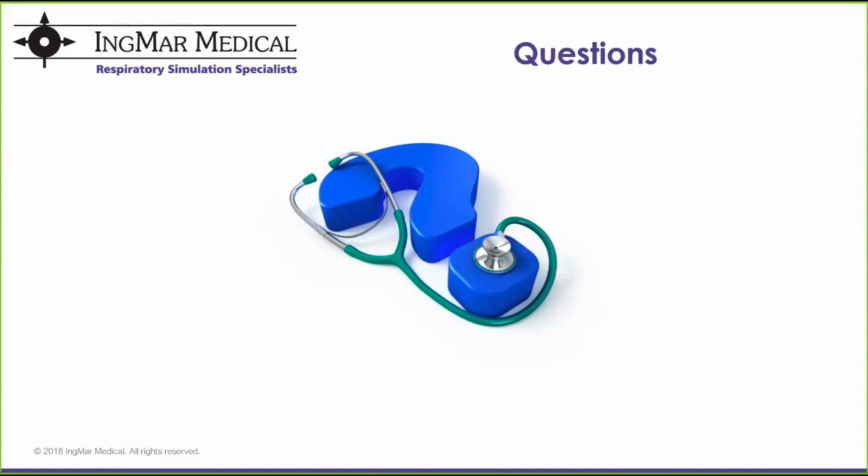We have another question here from Tom. Tom asks, how does the ASL hook up to the SimMan? Can a center install it, or does it have to be installed by Laerdal? That's a great question, Tom. The ASL does require a physical component to be integrated with the SimMan. We call that the lung adapter. The lung adapter is a piece of hardware that is installed inside the torso of the SimMan, and that installation is done by Laerdal field service engineers. So when you are speaking with Laerdal about purchasing this product, one of the discussions will be about that installation.